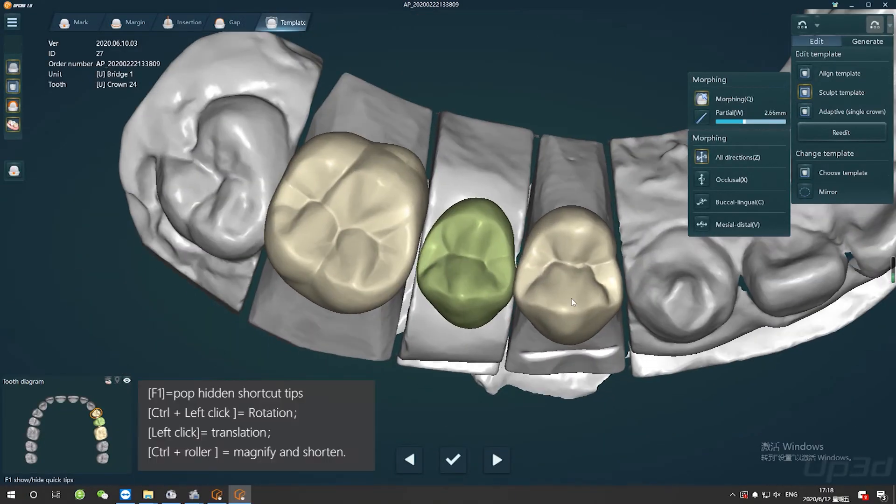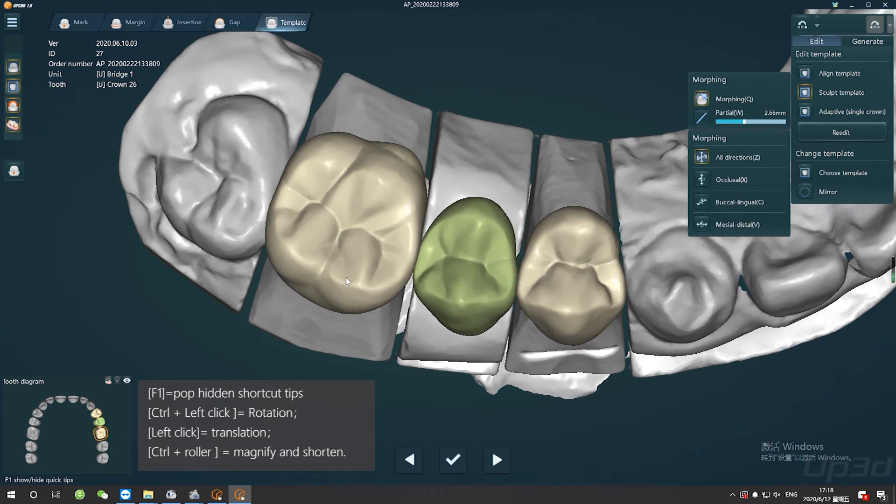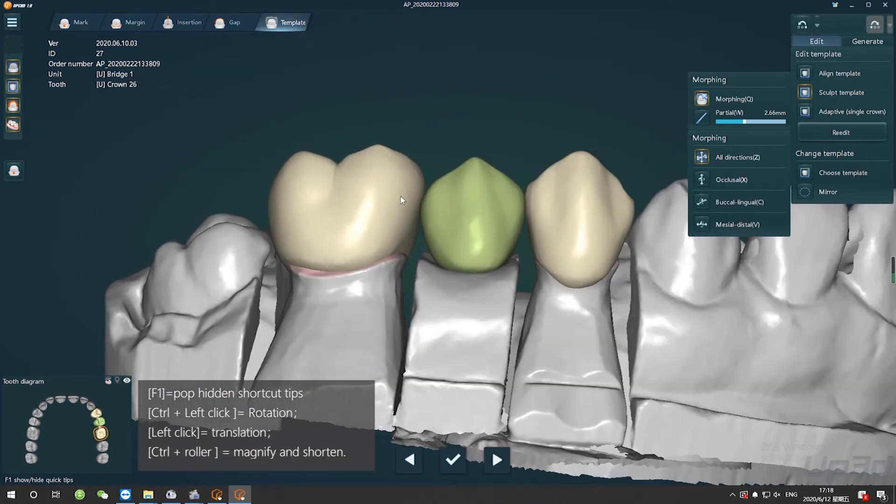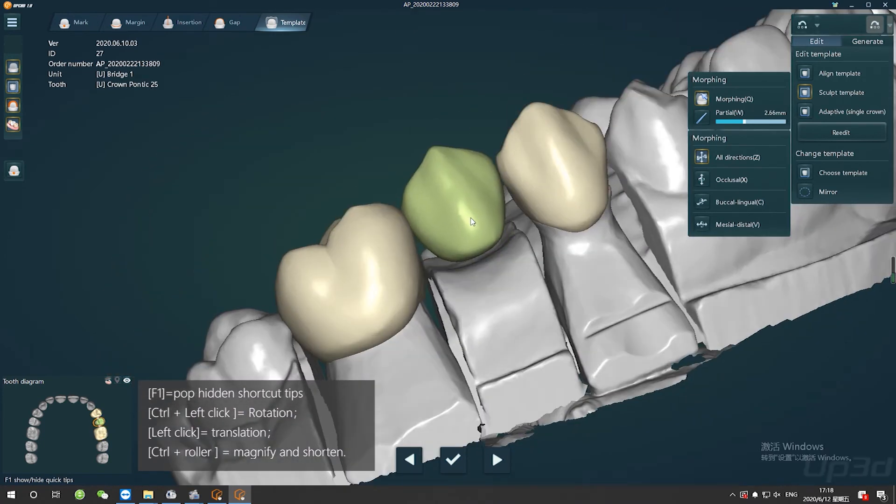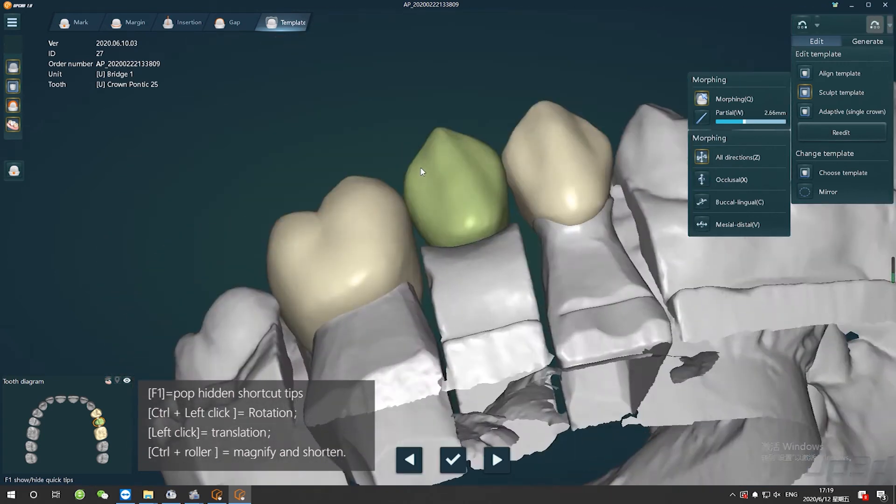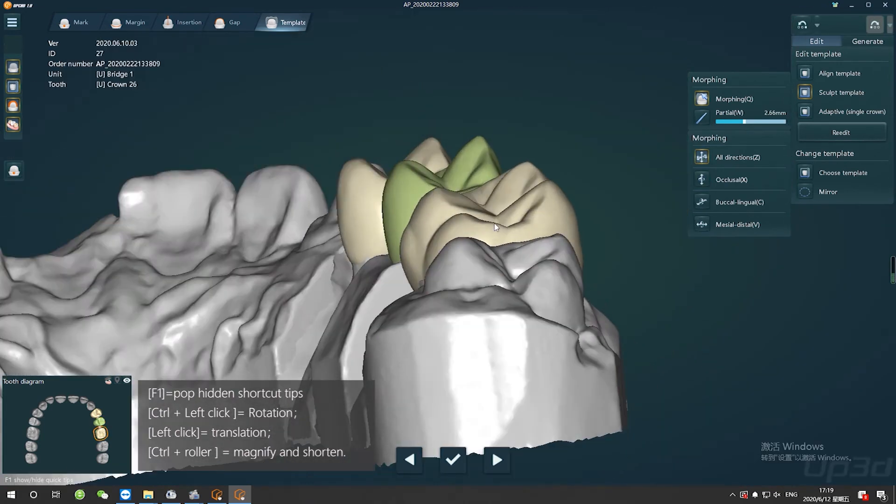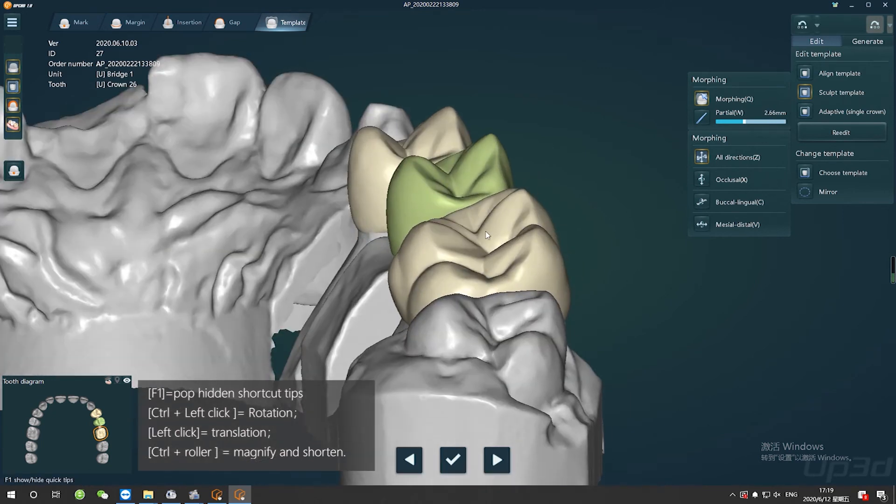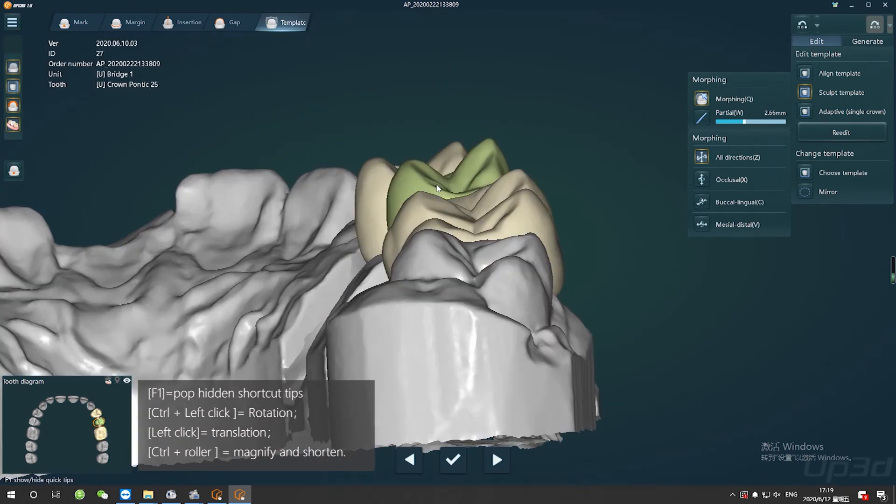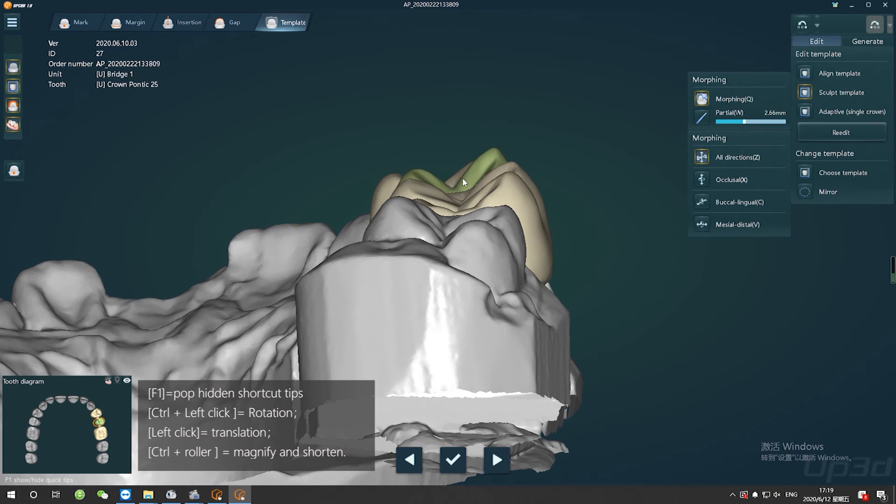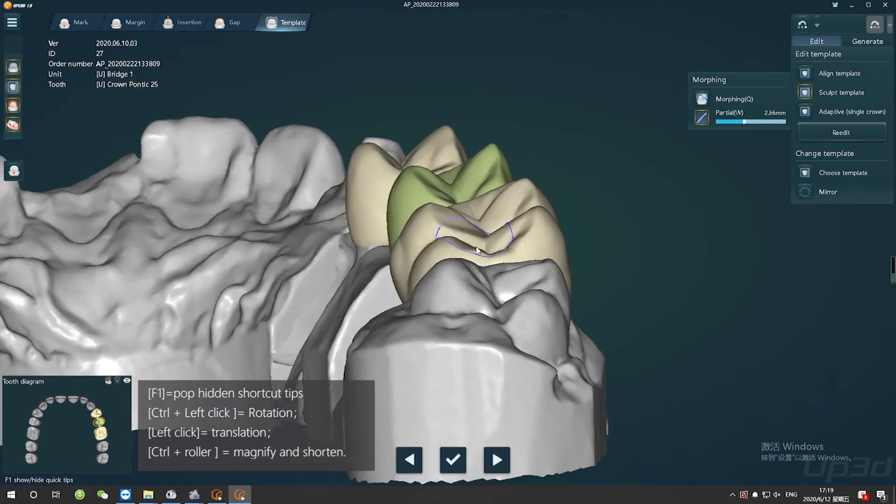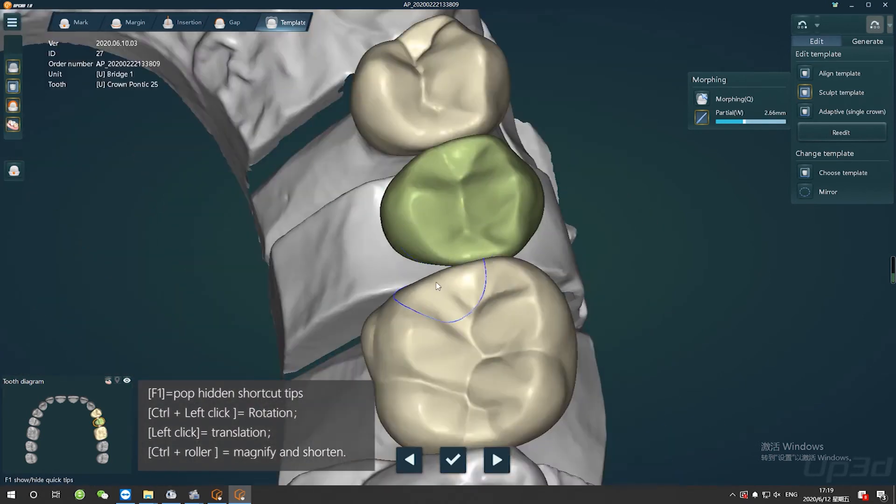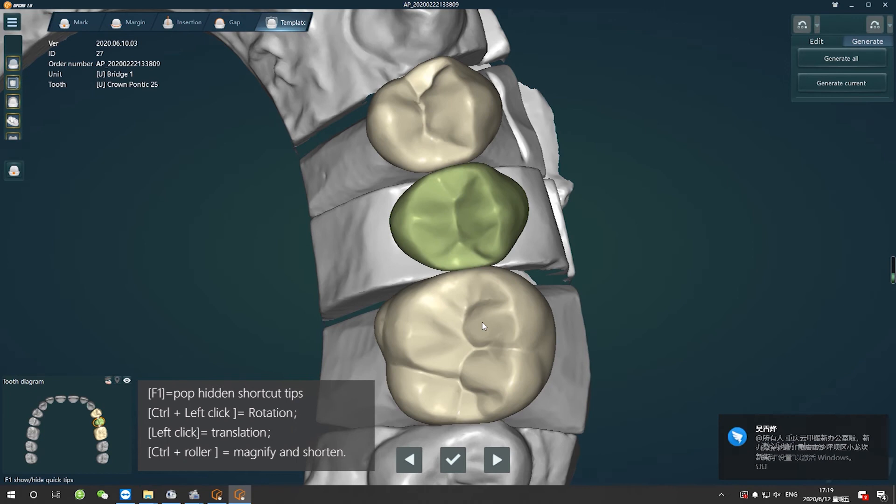Here I will show you the basic tooth arrangement shortcut keys. Press F1. The left lower corner will pop out hidden shortcut tips. Control and left drag means rotation. Left click simply means translation. Control and wheel means zoom in or out. And then we need to adjust the position of the tooth to a proper size, reasonable spacing, and ensure its functionality. Then click next and you finish this step.